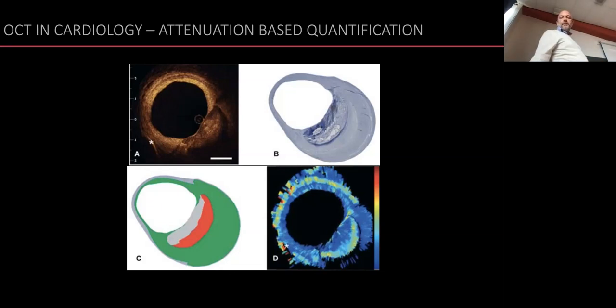Is that completely right? That's stuff that is still going on in cardiology. But in very large studies, patients that come into the hospital here or at the AMC location all undergo an OCT, or what we call a similar trick, but with echo, intravascular ultrasound pullback. Within those studies, they try to find correct cutoff values, for example attenuation coefficient or other things. So that was what I call benign applications: ophthalmology and cardiology.